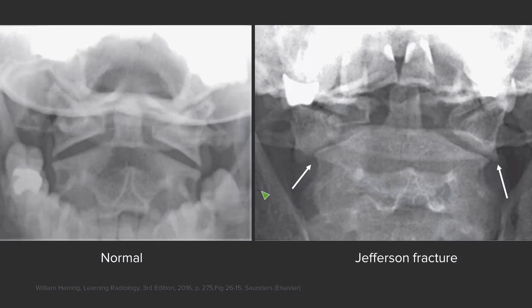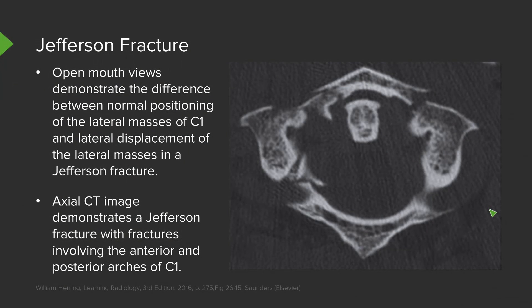Comparing with a normal film, the lateral margins of C1 and C2 are well aligned, while with the Jefferson fracture there is a step-off on both sides. On CT, you can see fractures involving both the anterior and posterior arch of C1. Because C1 is a ring, rings typically fracture in two places, so if you see one fracture you should look carefully for a subtle second fracture.